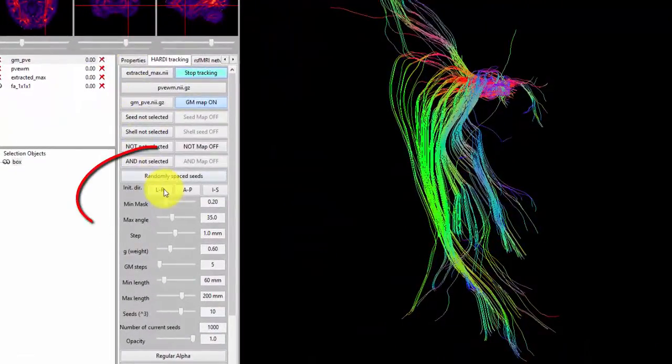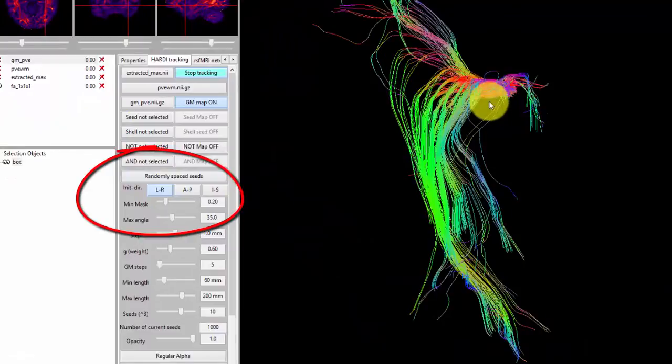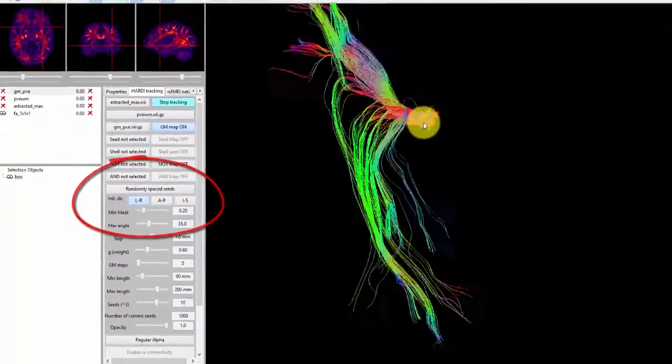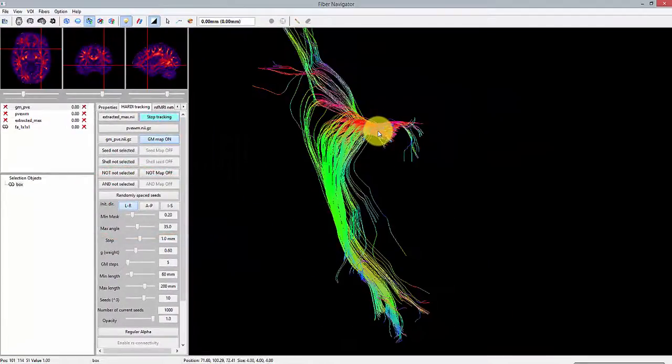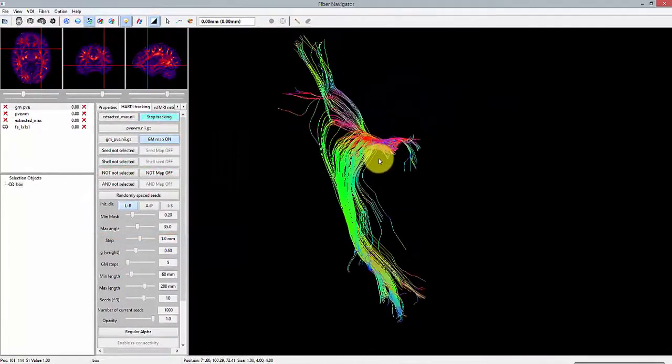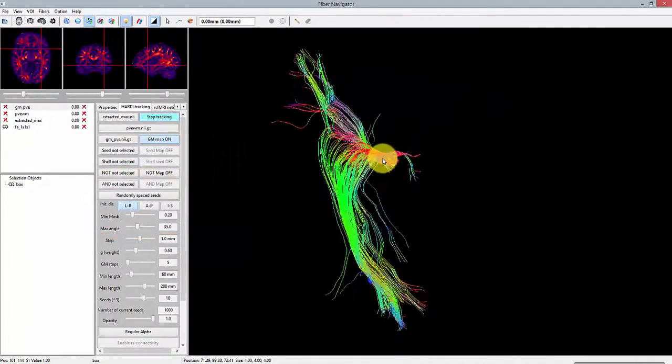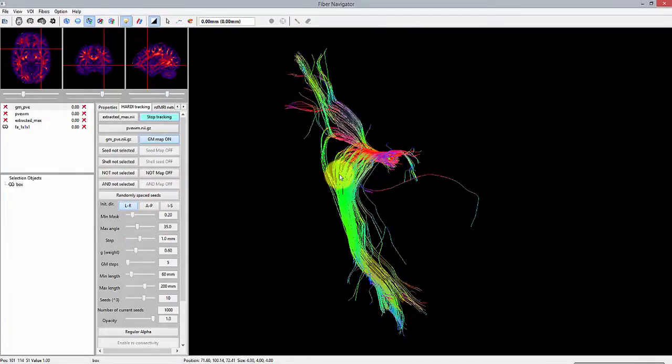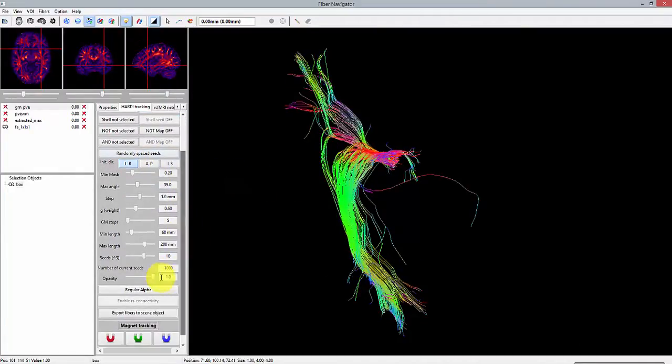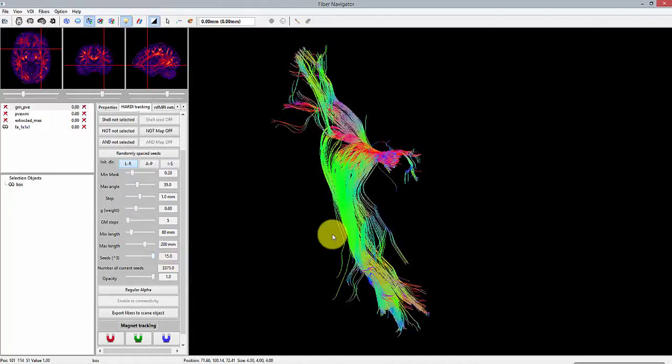Another advantage here is to easily find the LGN, which is a key region in the reconstruction of the optic radiation. So now, I initiated the tractography in the left-right direction to ensure that streamlines will propagate towards the Meyer's loop.